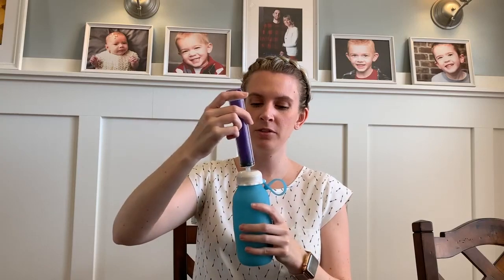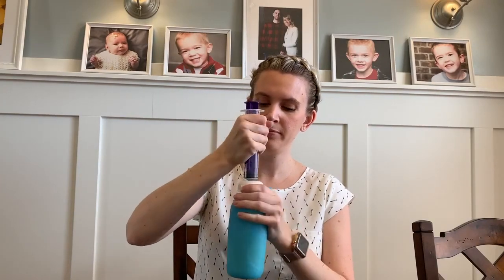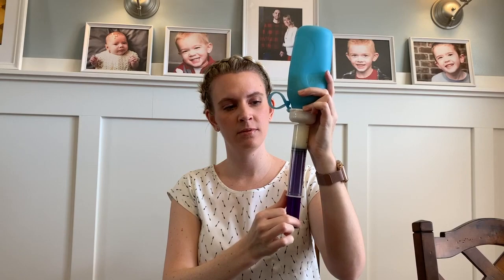Then we can take our N-Fit syringe, screw it into the cap, and draw up our feed. Here I've just put in milk to show how it works, but generally I use blends.